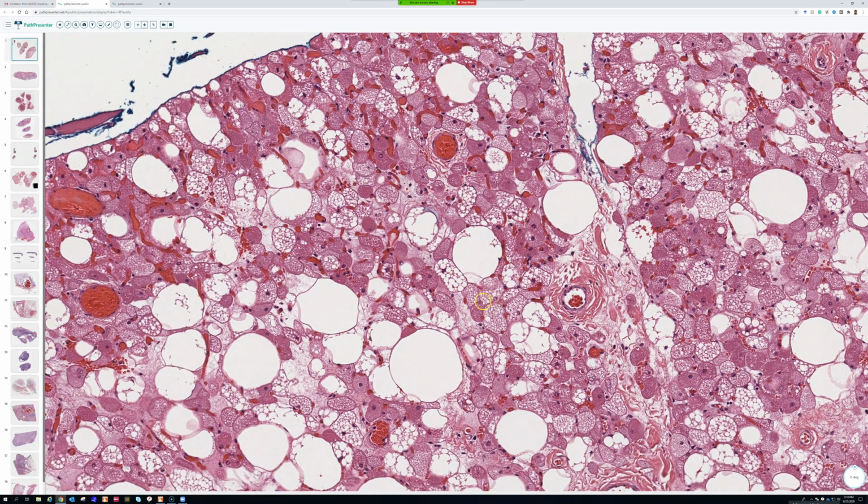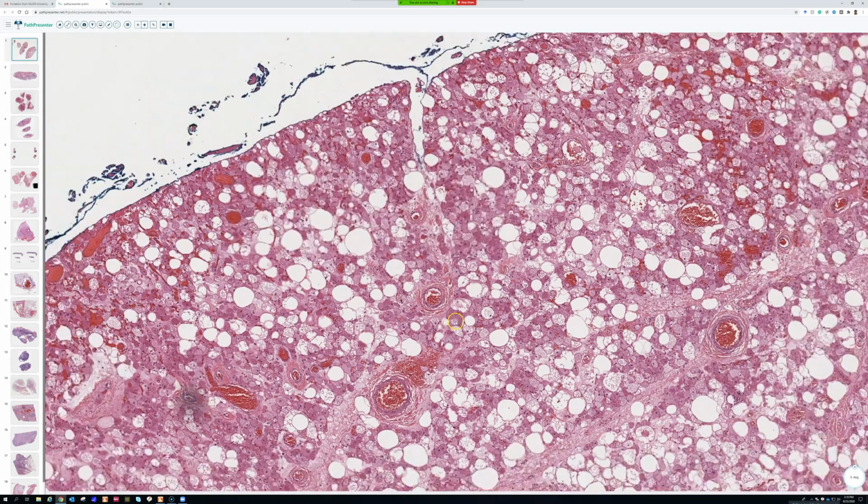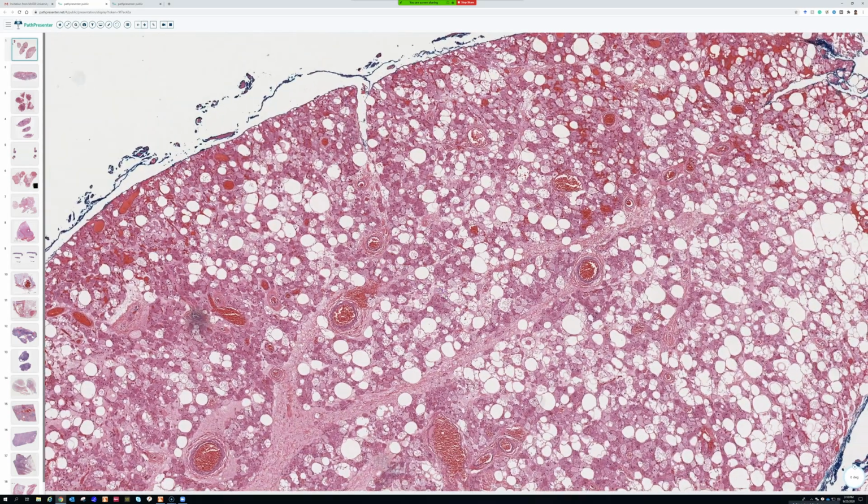So anyway, the thing that is also important to know is that while this hibernoma is very rich in these red, grainy cells packed full of mitochondria, not all of them are. Some hibernomas have mostly white fat and just a little bit of the reddish cells or the multivacuolated bubbles. So all 3 of those cell types can be present in varying proportion in hibernoma. These tend to occur in young adults. They tend to be decent size. Sometimes it can be 5-10 centimeters and down in the deep musculature.